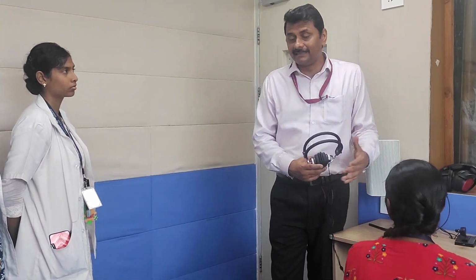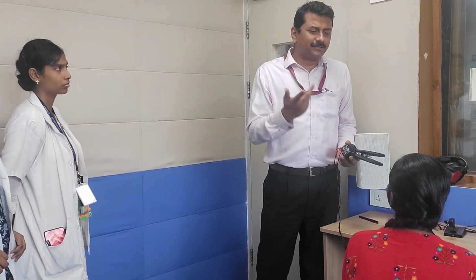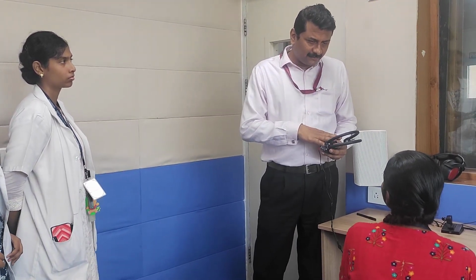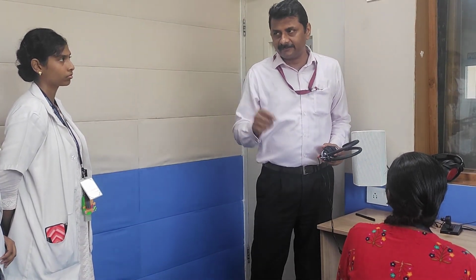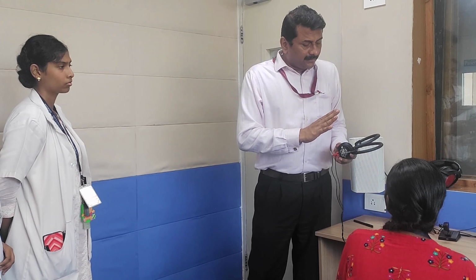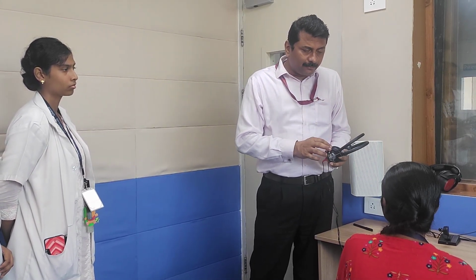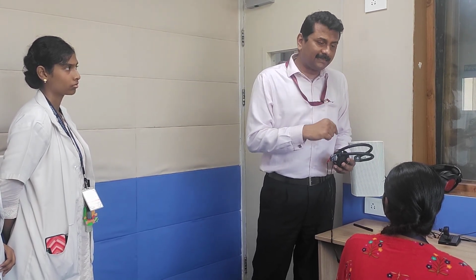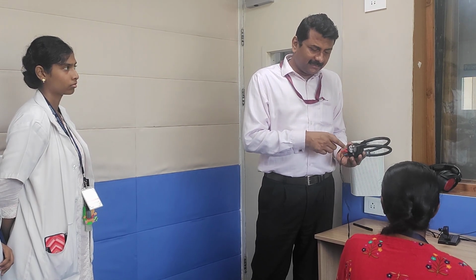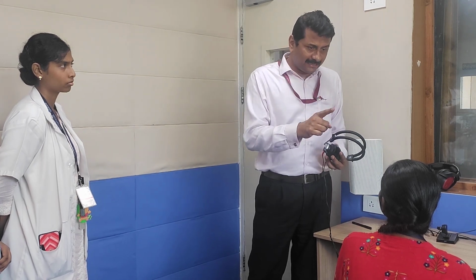This is how the instructions are done. It starts like this. See, you have come here with a hearing loss, or you have come here to test your hearing. For that, we are going to perform a test known as pure tone audiometry. Step 1, you inform the test. Okay? In this pure tone audiometry, we have your audiometer there, and these are the headphones. I'll put these headphones to your ears, and I'll test one ear at a time. Right ear with red, and left ear with blue. So I'll put the headphones, I'll test one ear at a time.